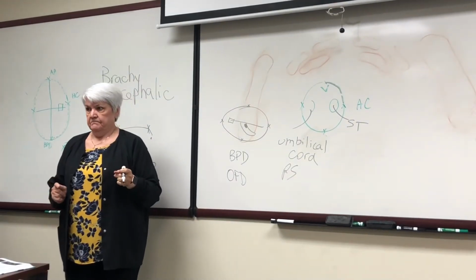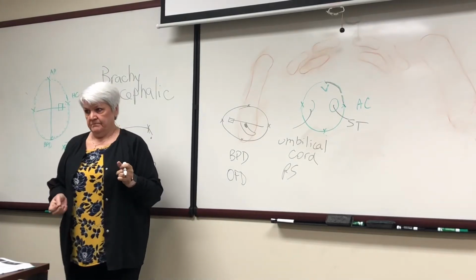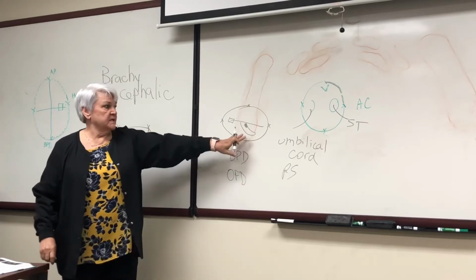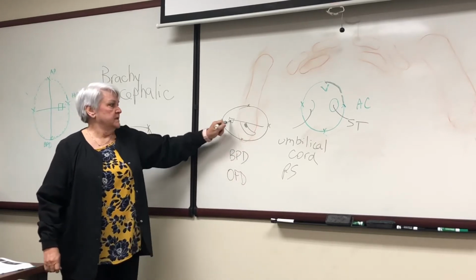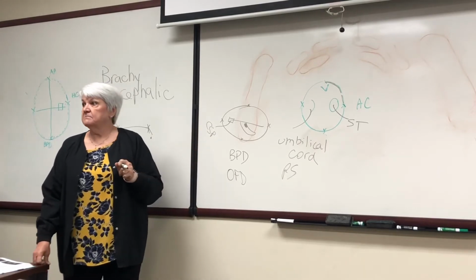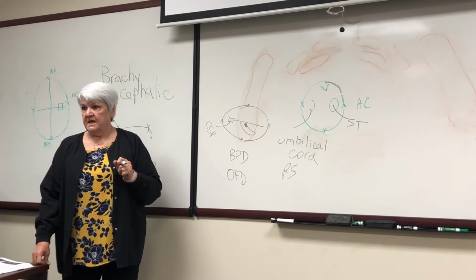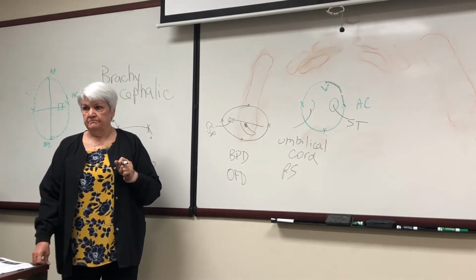Occipital frontal diameter. Okay? Occipital frontal diameter. This is the level you want to be. This is the CSP, cavum septum pellucidum. Okay? Cavum septum pellucidum.